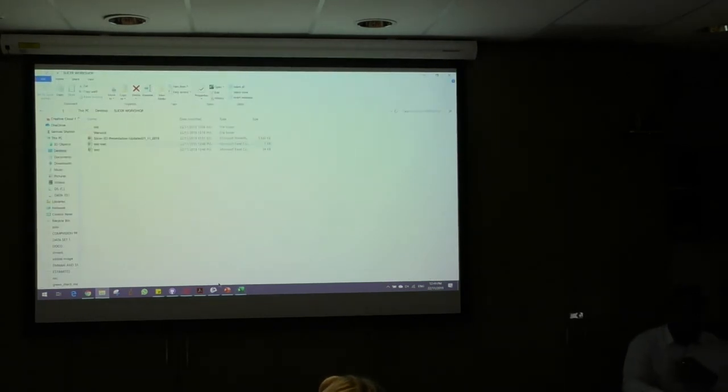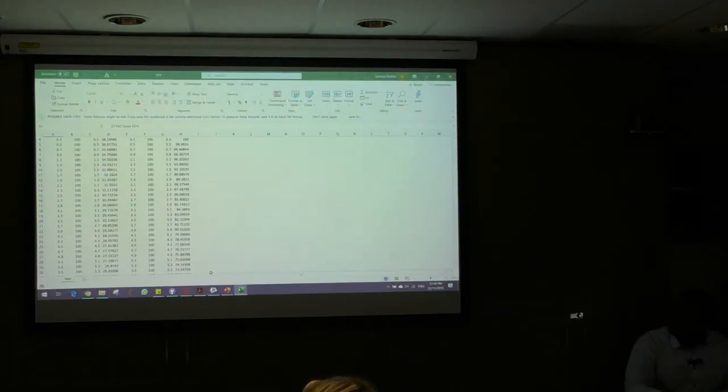With the DVH data, do you know, is there a way so it's not going like every 0.2? Can you make that like every 0.1 or something? You can, but you have to get into the source code.